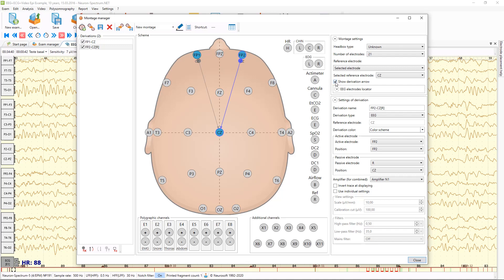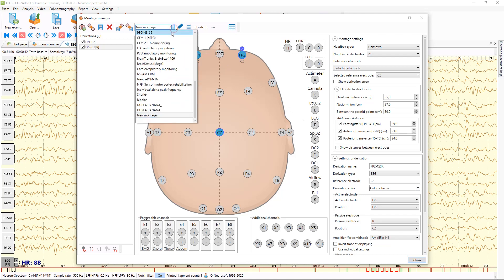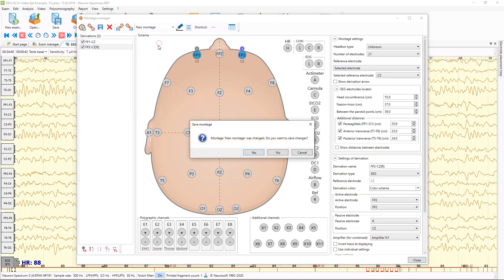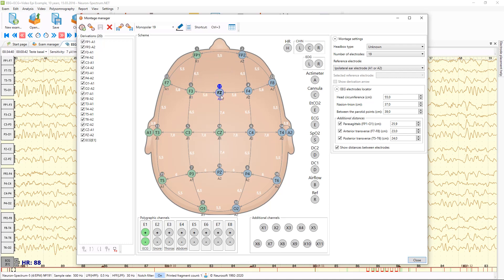Also you can show derivations with arrows, and you can use the locator to calculate the distance between electrodes. I'll show it on another montage because this one does not include enough derivations. This distance will be visible during impedance measuring and will help your nurse to place electrodes correctly according to the 10-20 international system.